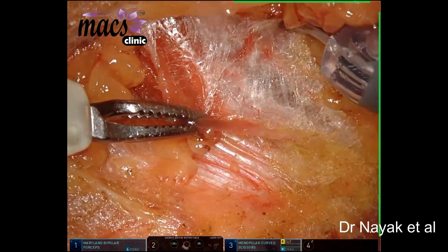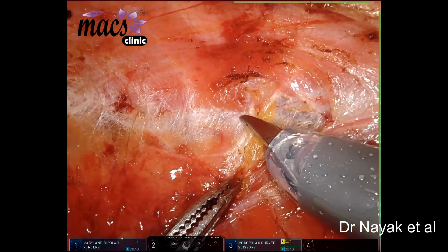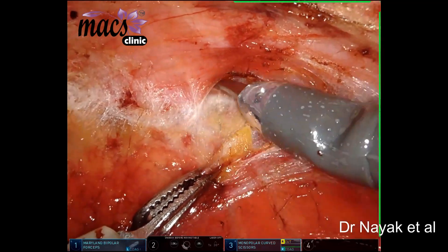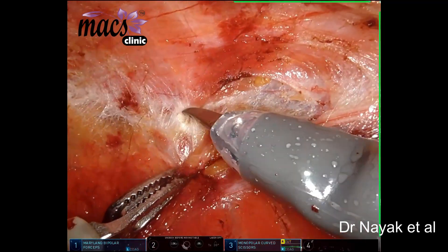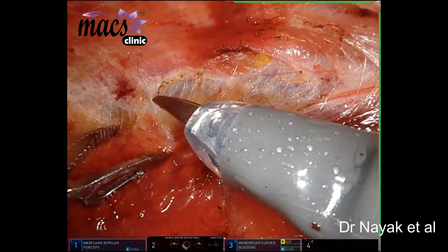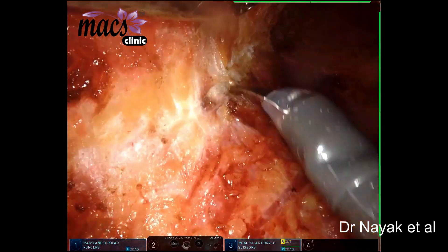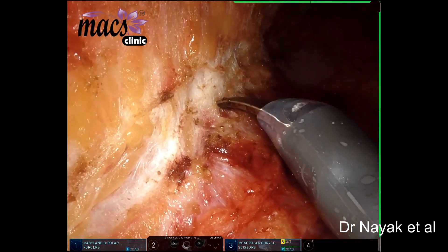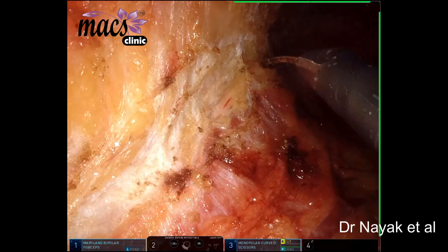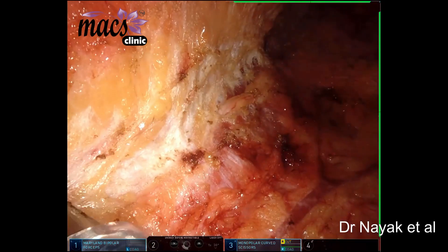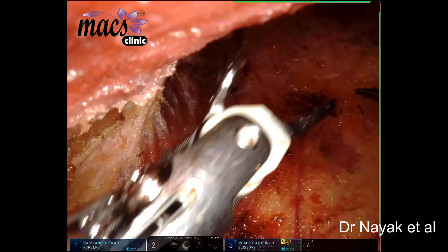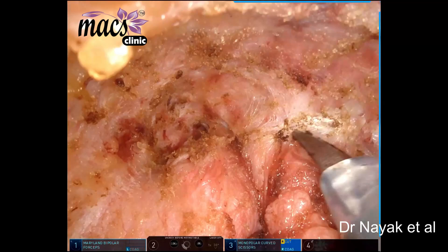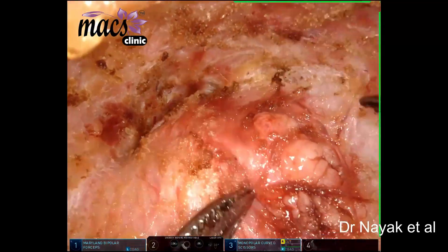We are going from the infraclavicular region and heading superiorly. That is the platysma. We raise the platysma and go along this plane to reach the parotid. Here we can see the greater auricular nerve along the posterior surface of the sternocleidomastoid. This is the parotid tumor. We have raised the entire flap up to the upper end of the lesion.